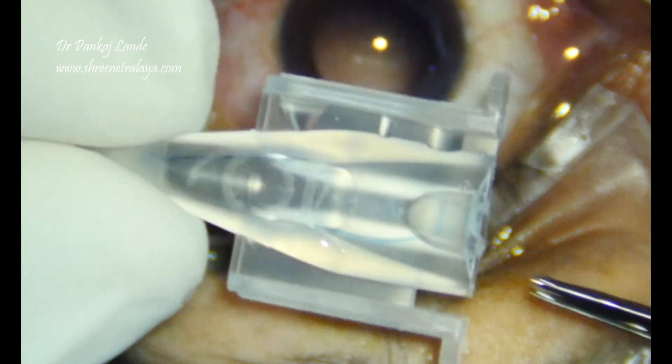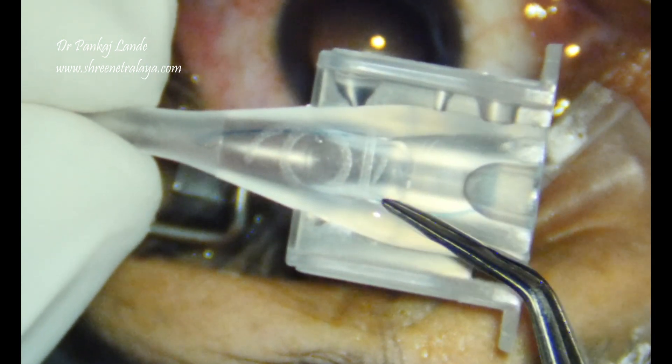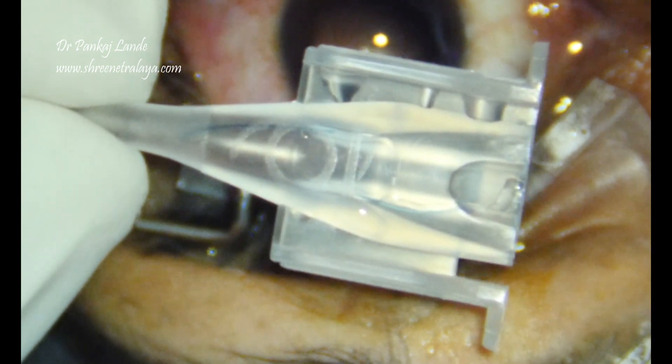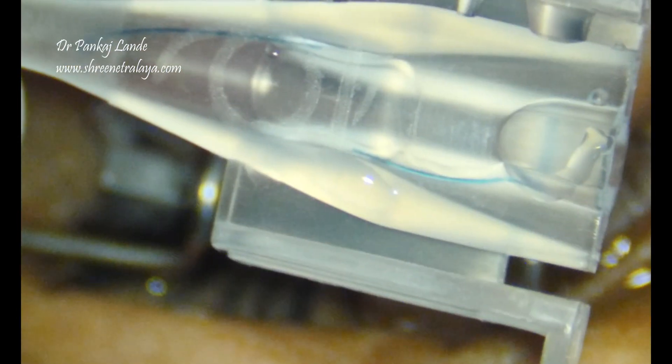While injecting into the cartridge, I am making sure that my leading haptic is not C-shaped and the trailing haptic is following without any kinking.